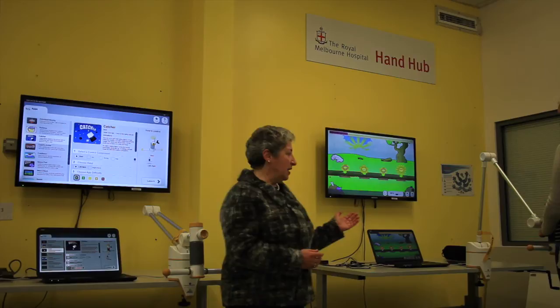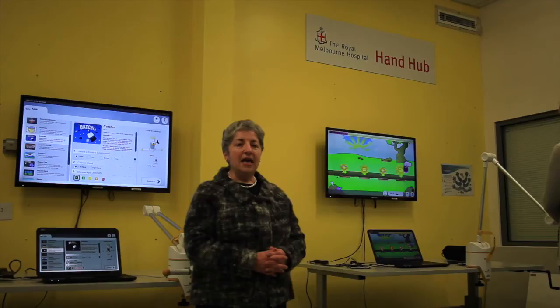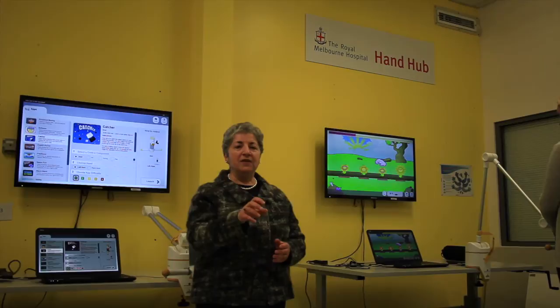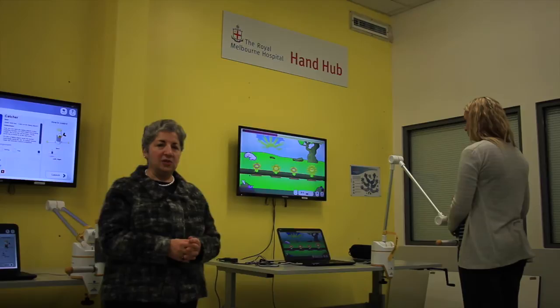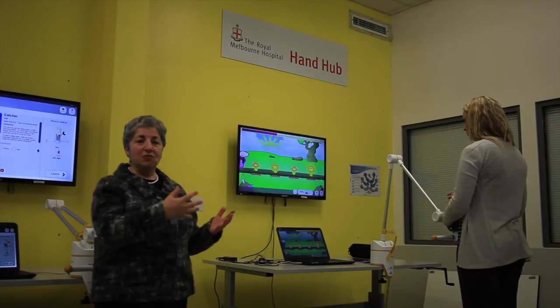Behind me we have a device called the Rejoice workstation, and this enables people to use various movements of their hand to play the game. This particular game requires a person to have a pincer grasp — a very fine grasp — and people get to practice that during the game. Their success is recorded and they can try to beat their score from occasion to occasion.